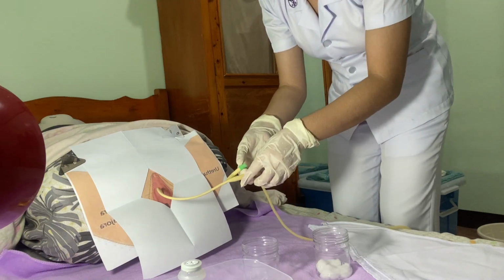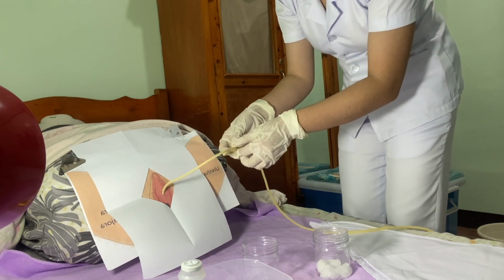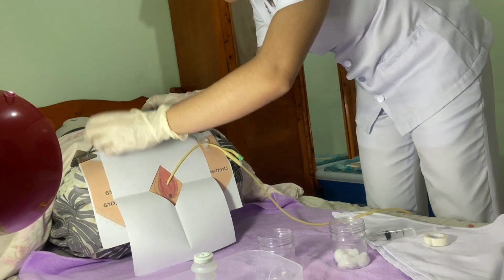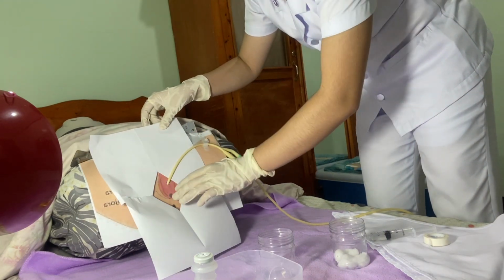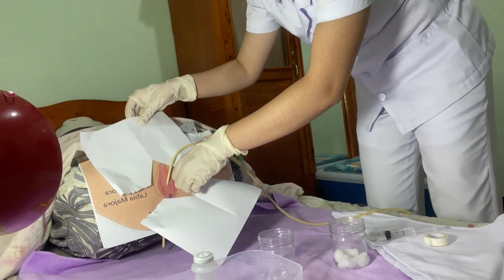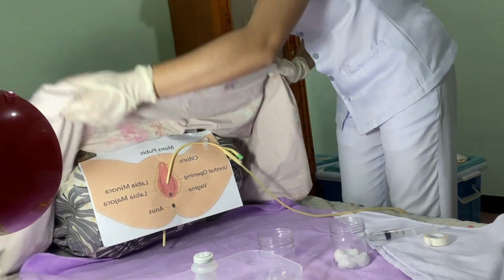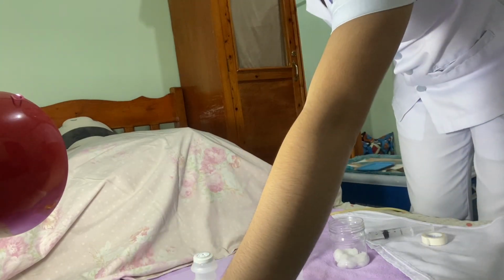Okay, so now we have to secure the catheter by taping it to the patient's thigh and allow some slack of the tubing to accommodate the patient's movement. Okay, after that, we have to remove this eye sheet. Okay, and then we have to place the patient comfortably. So I'm gonna remove this one. And I'm gonna turn off the light.